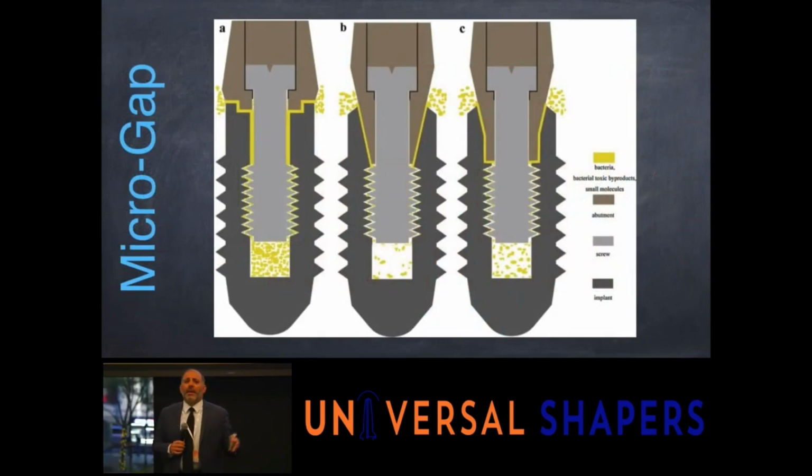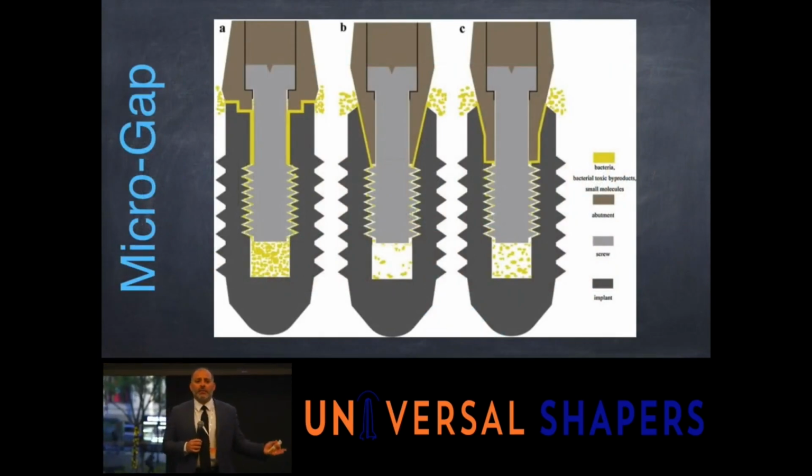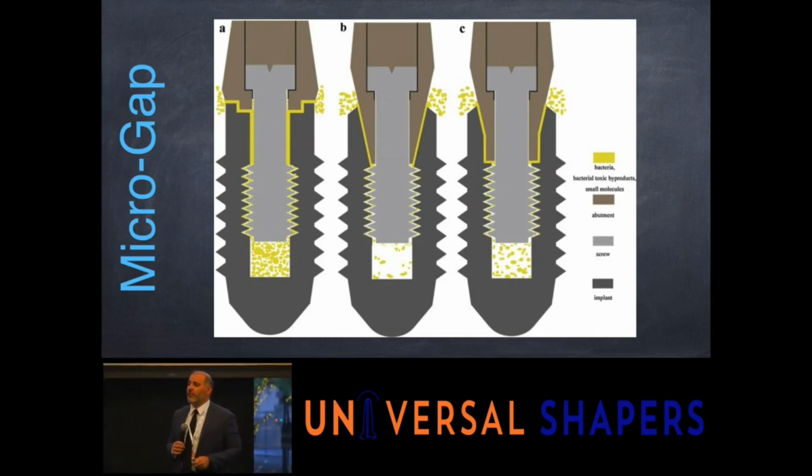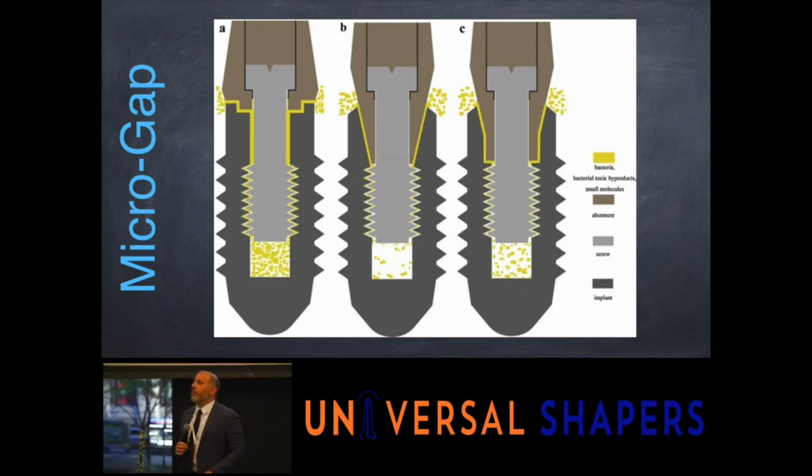So we'll talk about the microgap. We can debate that to death. You know, this implant has a microgap. That implant doesn't have a microgap. I have less bacteria in this implant because of its conical connection, and when it has this type of connection, I get a little bit more. But when I have this butt joint connection, I get a ton of bacteria.